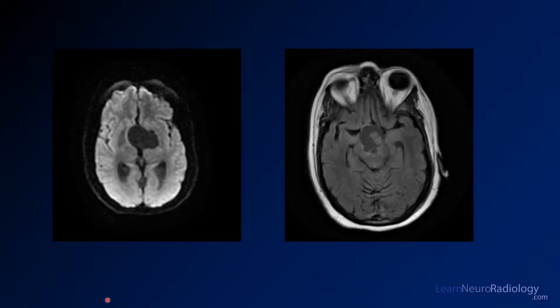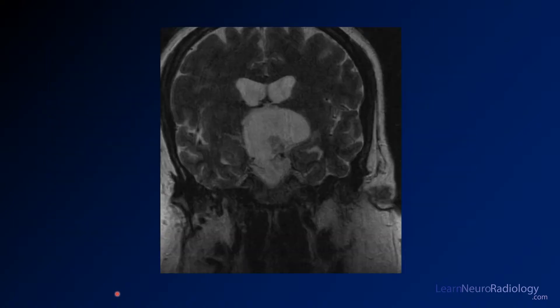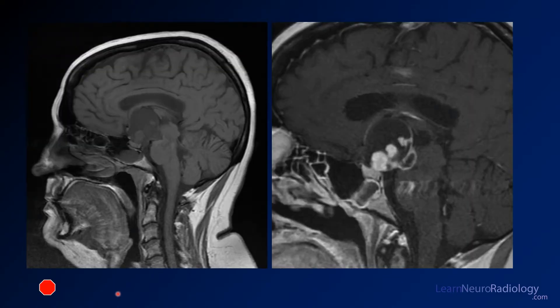Now we have some MR images. On the left, this is diffusion; on the right, this is FLAIR. Here's a coronal T2 image, and we'll finish up with pre- and post-contrast imaging.